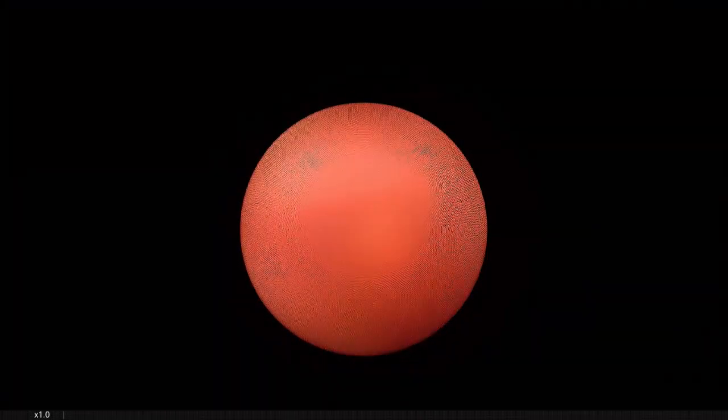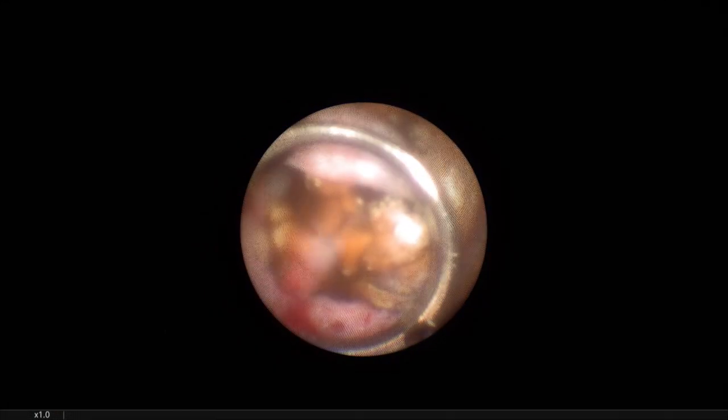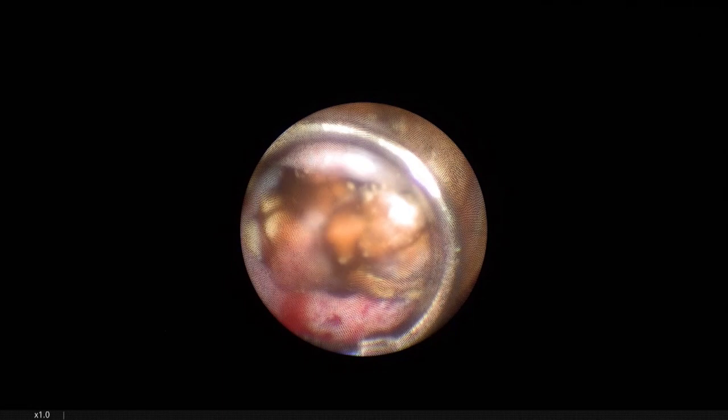There is some pressure on the irrigation. You're not using the pump? No pump. Never. I don't have a pump in my department. You use gravity? Yes, because gravity is available everywhere and is free of charge.